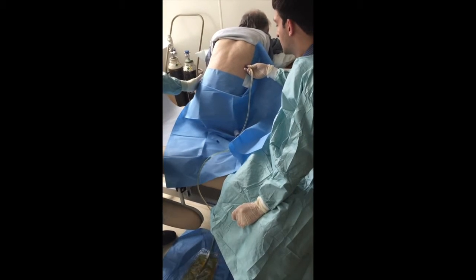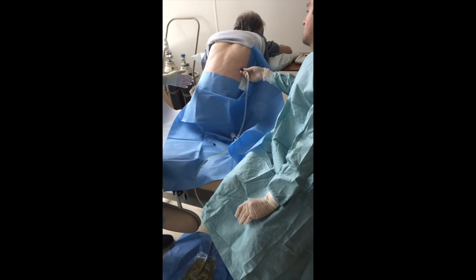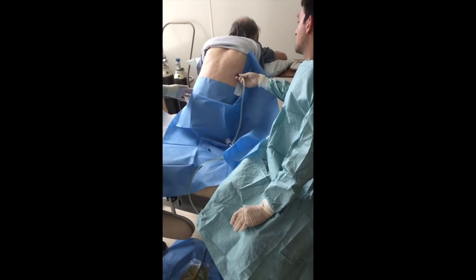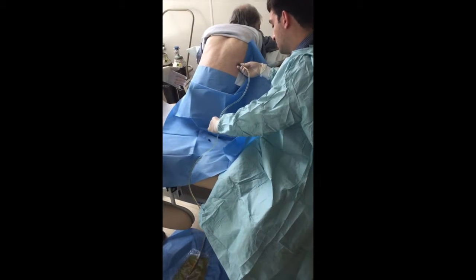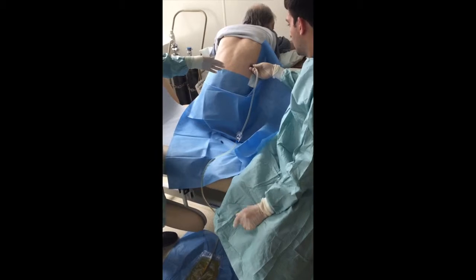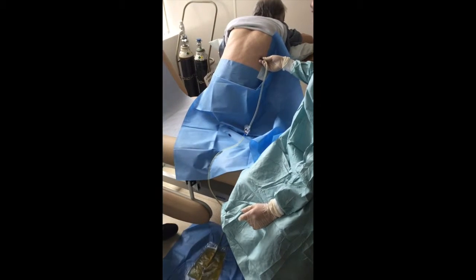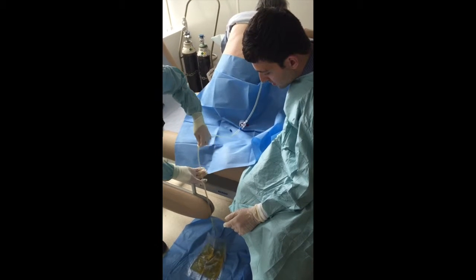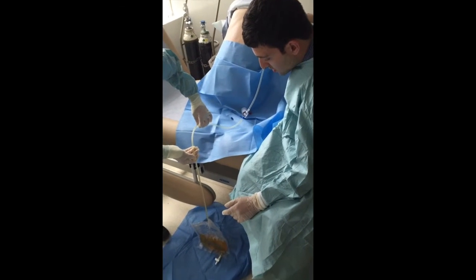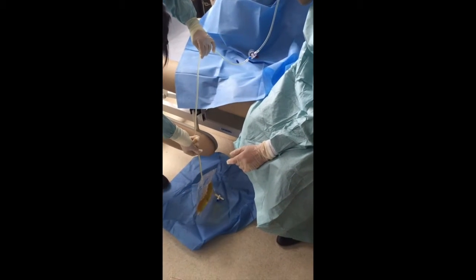So how are you feeling now? Are you feeling okay? Fine, yeah. Good. Sometimes you get a bit of tightness in your chest as we drain this fluid off. Will you let us know if that happens? Yeah. And sometimes it makes you cough a bit. So again, just if you need to cough, it's safe to do so because there's no needles in there, it's just a plastic tube. Right. Okay, so let's just have a look how much fluid we've got so far. So you can just see from this bag that there's about 600 or 700 mils of fluid in there, so we're not too far off finishing now.